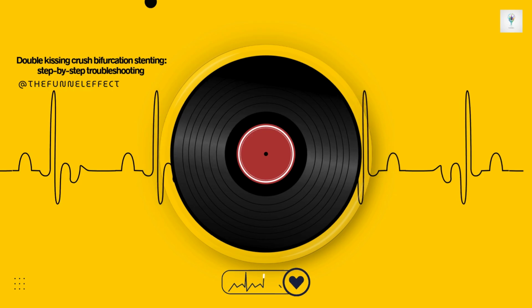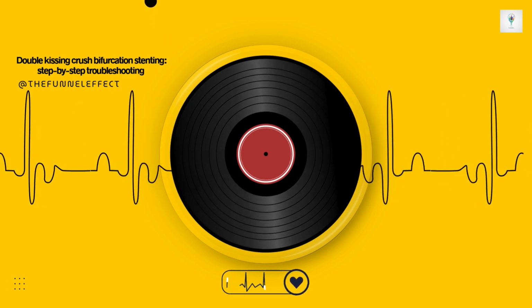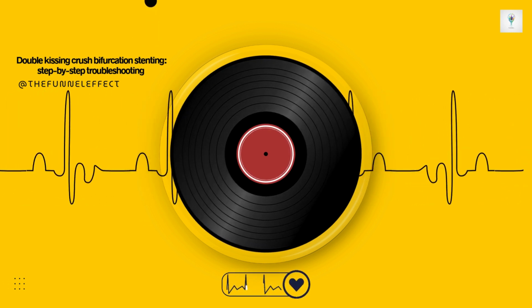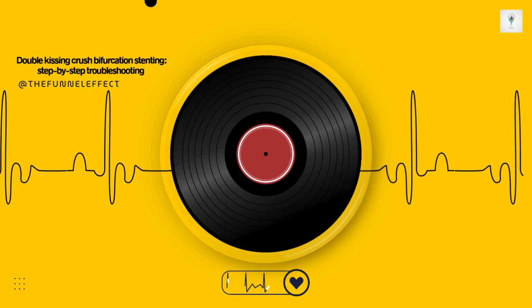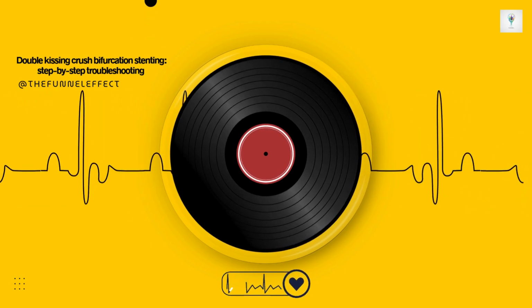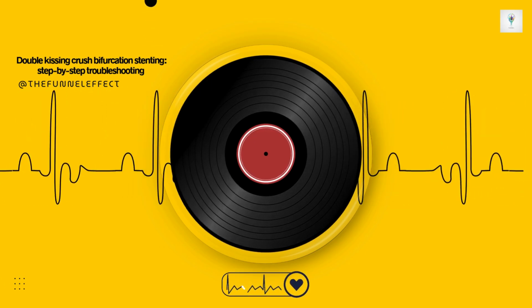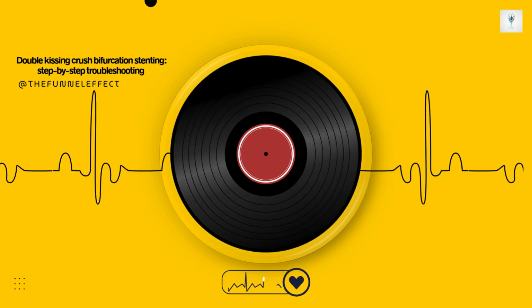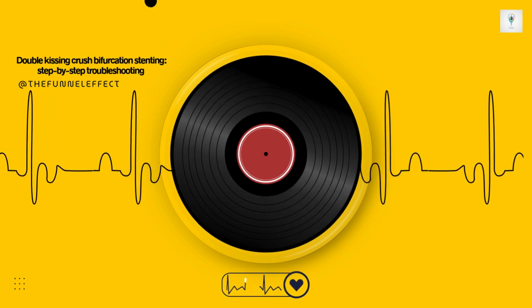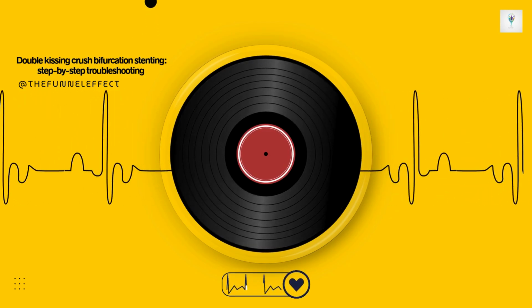Second, and this is crucial for the next steps, POT fundamentally reshapes the stent struts right at the bifurcation. It flares them outwards. This does two things. It makes it much harder for the wire to accidentally go behind the MV stent struts when you rewire the SB again later, which is a disaster. And it maximally opens up the window or cell of the MV stent that's sitting over the SB ostium, improving access. And getting the POT balloon position just right sounds critical for that first POT.